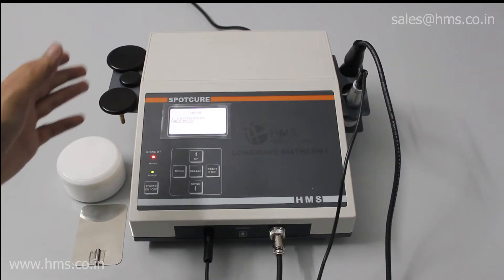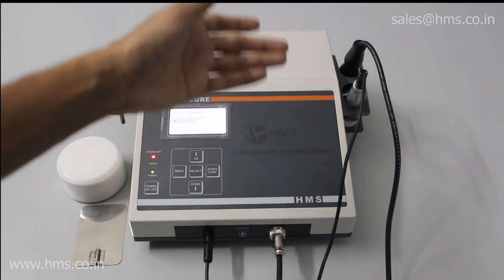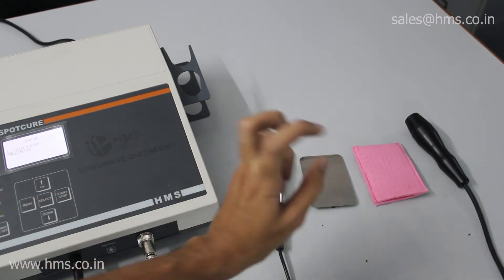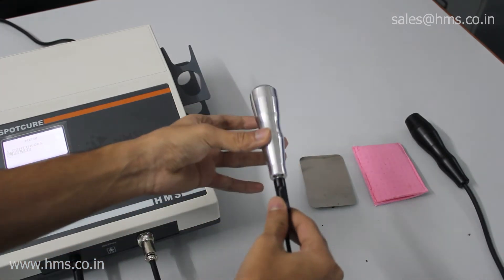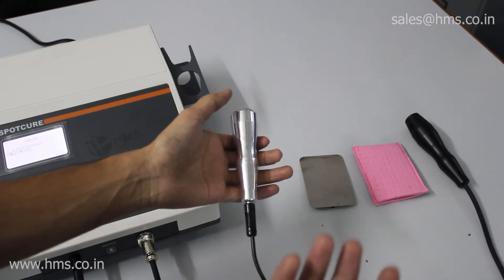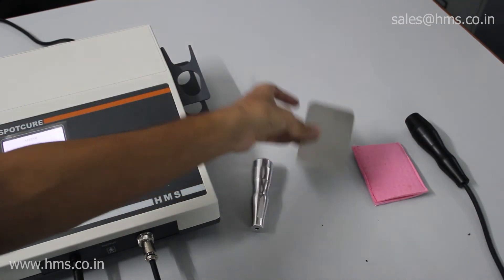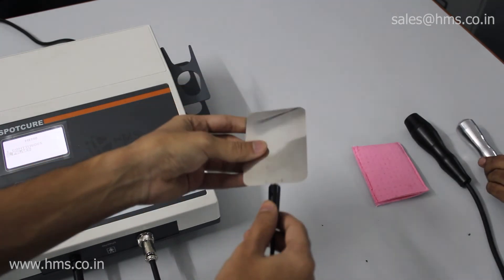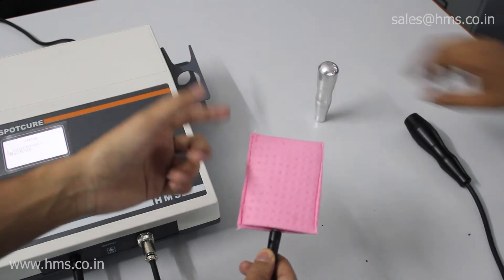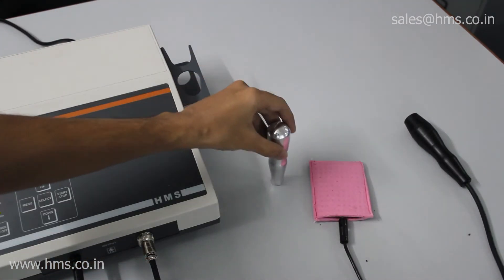Now we'll see how to operate the device overall — how to use the applicator and the inactive probe. The inactive probe that can be held in your palm is connected to the cable. If the patient feels uncomfortable, you can replace it with the inactive plate. This inactive plate must be kept inside the provided pouch, and the pouch must be wet for the treatment to be more effective.